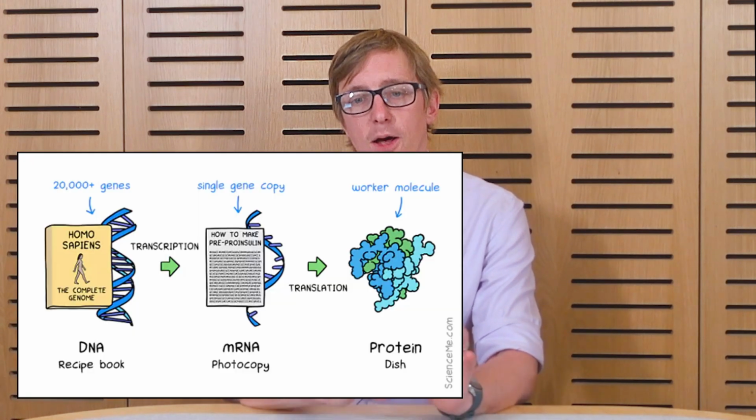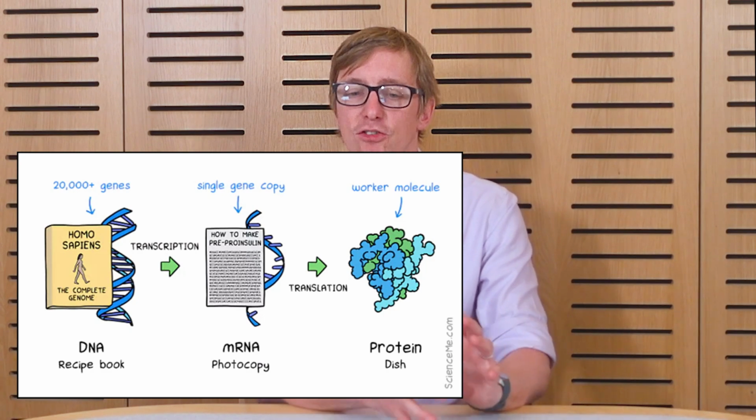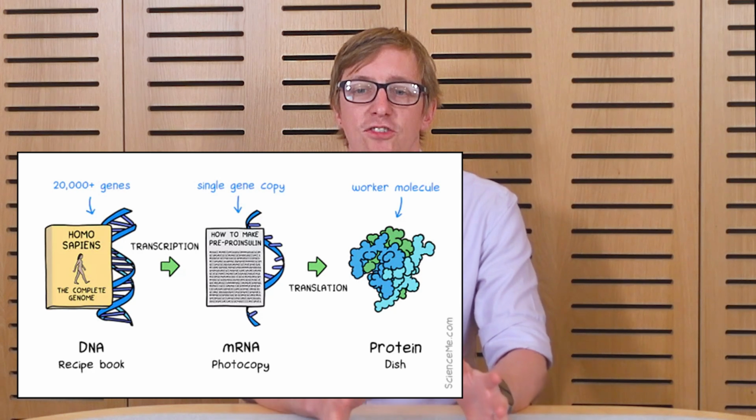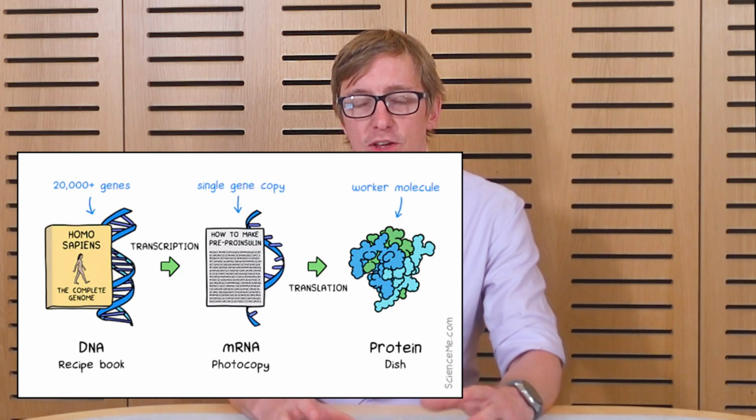Again, if you want more detail on that, there'll be plenty more information out there in nice videos explaining polymerase chain reaction. Crucially, in chronic myeloid leukemia, we need to be monitoring the RNA. So as we talked about in an earlier talk, the recipe book is your DNA, but it's very, very hard to turn that into a good laboratory test, which accurately measures the amount of BCR-ABL there is.